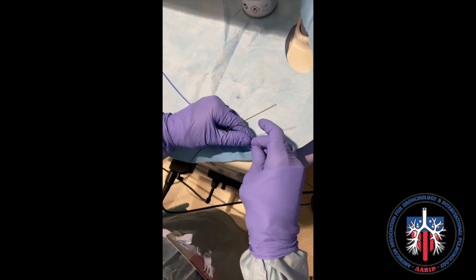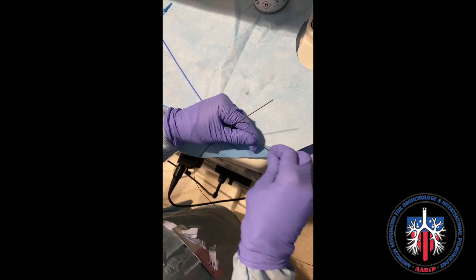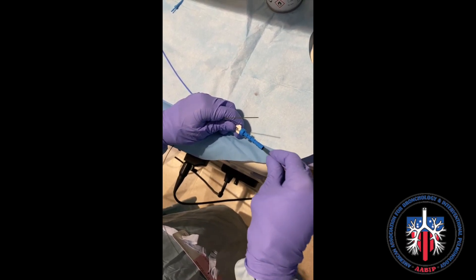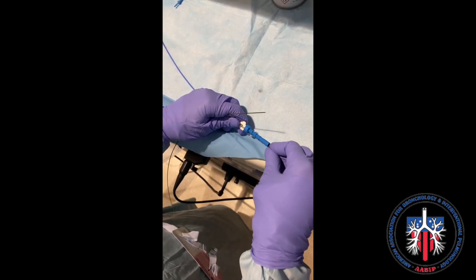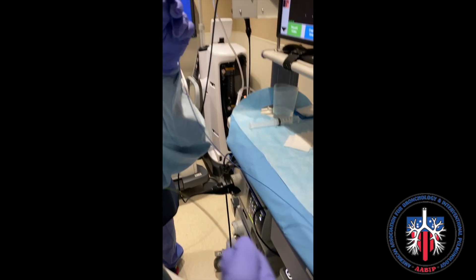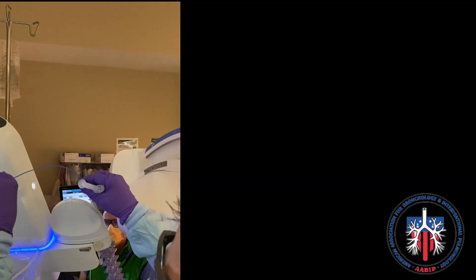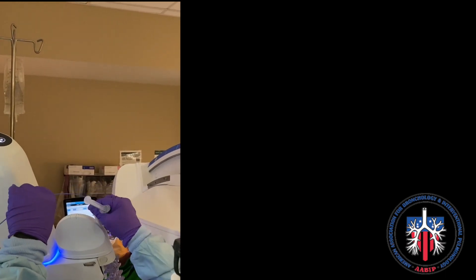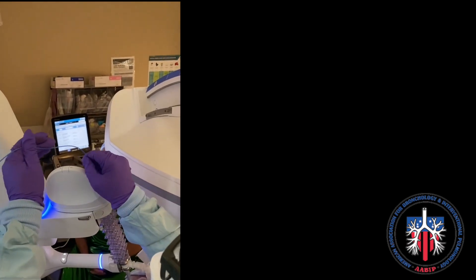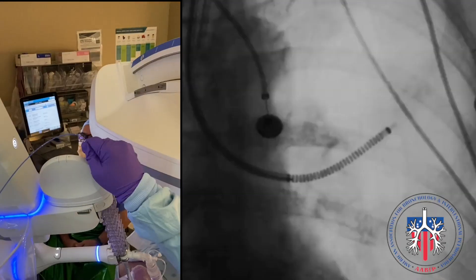The catheter is advanced to reach the level of the fiducial, positioning the fiducial closer to the tip of the catheter. When the guide wire has reached the maximal distance, the fiducial marker is within the catheter but close to the tip. The catheter is then loaded into the ion robotic working channel. Multiple markers on the additional part of the catheter — visible as white markers — indicate position.